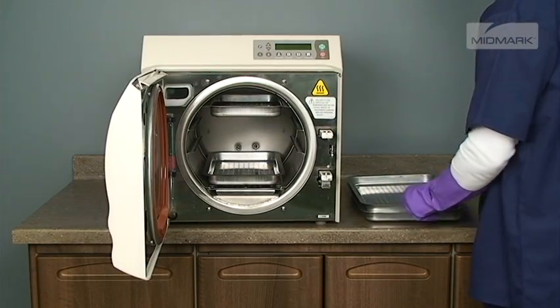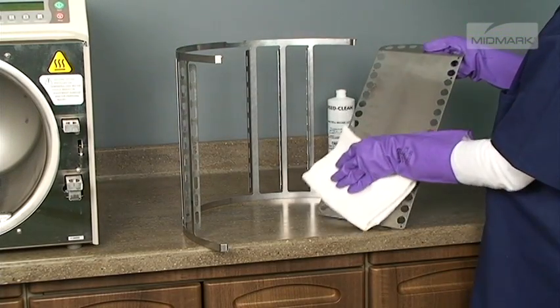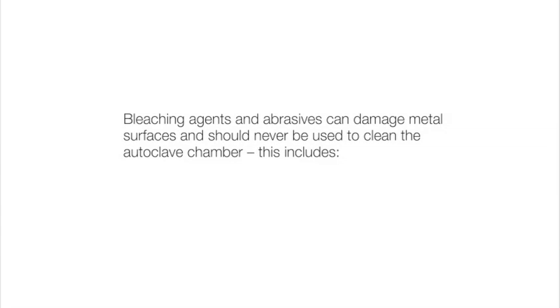After removing the trays and rack from the autoclave, clean the trays and the inside of the chamber with distilled water and speed clean or a mild soap. Bleaching agents and abrasives can damage metal surfaces and should never be used to clean the autoclave chamber — this includes steel wool, scouring powder, bleach, or wire brushes.